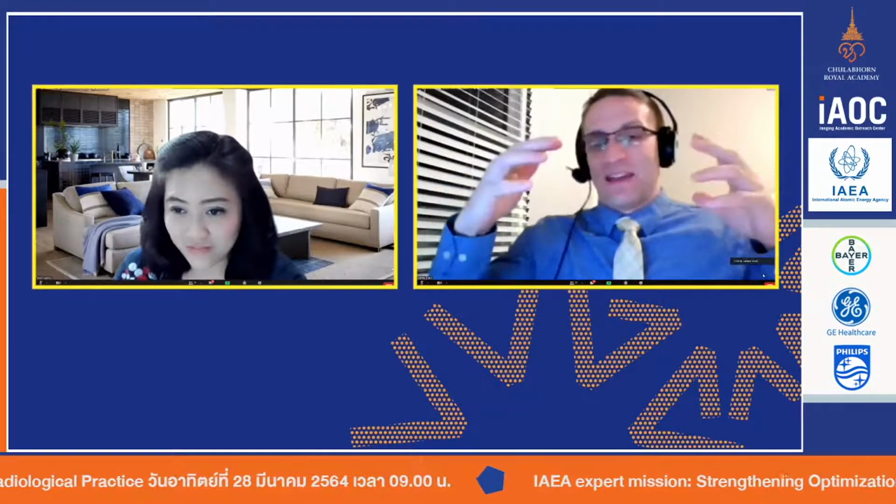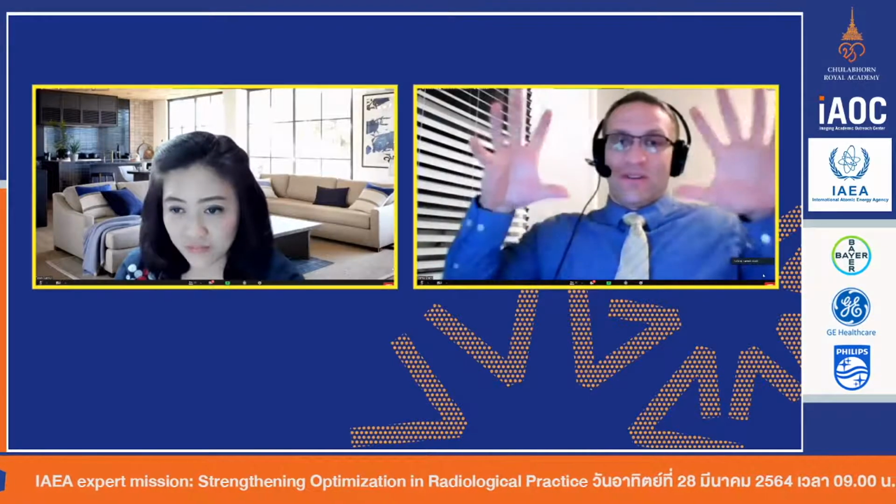So the one thing I did not talk about, because it's still mostly academic, is photon counting. That's where, kind of like in nuclear medicine, we physically count how many photons come out of the body and collect in the gamma cameras and the PET scanners. We know exactly how many photons come out. Therefore, we can reconstruct the image knowing how many photons are here and how many photons are here. We don't do that in CT. We just dump. It's like taking a big bucket of water and dumping it on your head. It's hard to count how much water got your hair wet. In CT, we can't count all those photons because we use so many photons.